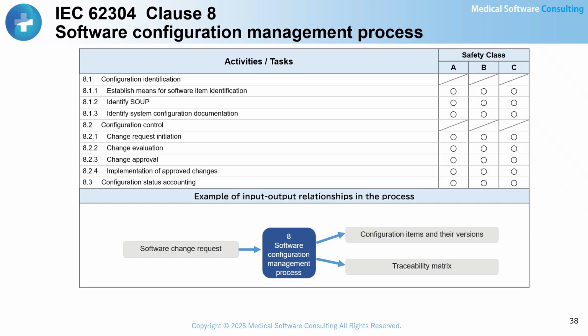Software configuration management is an essential process for software quality management, not only in medical devices, but in software development in general. Without proper configuration and change management, the likelihood of introducing regressions when making software modifications increases significantly. In the case of medical device software, if a recall is triggered by a software issue and configuration management is not in place, it may be impossible to determine which software version needs to be corrected.